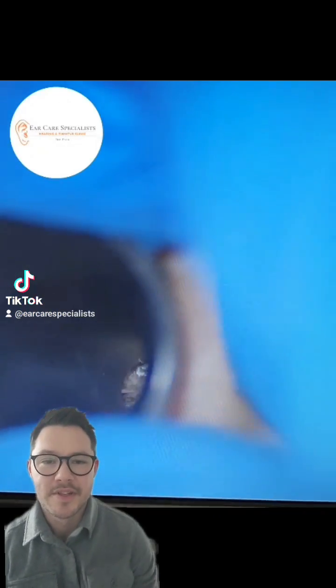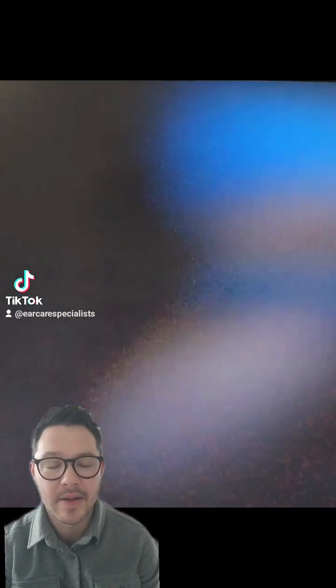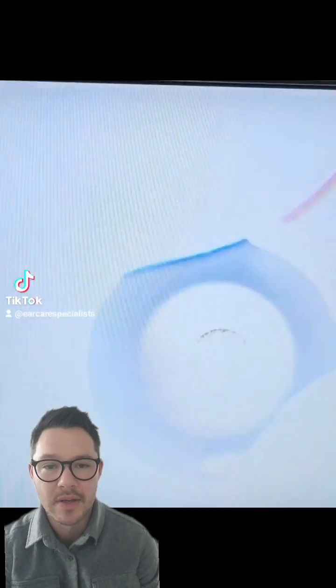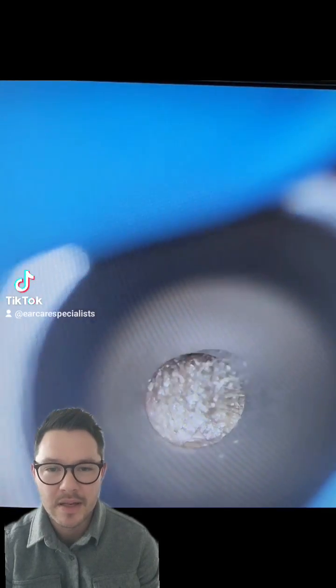Welcome back folks, this is Dr. Jeff here from Ear Care Specialists. This particular patient had quite dry, hard, occluding wax. Just flicking through the magnification levels there on the microscope — I think this is at times 7.5.